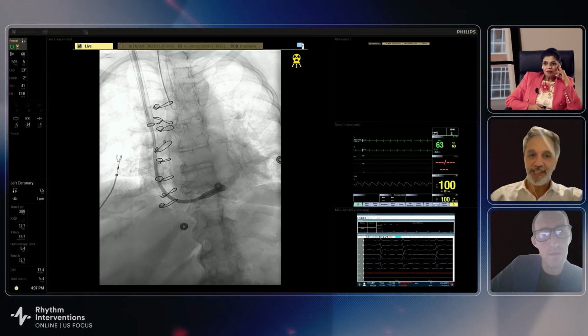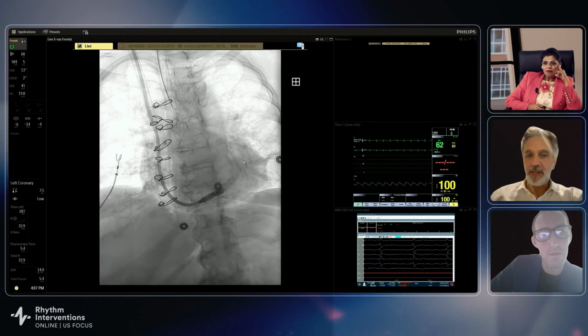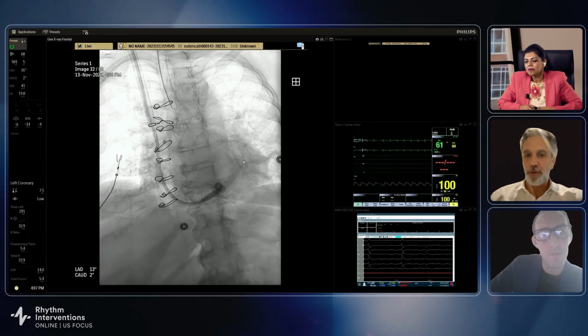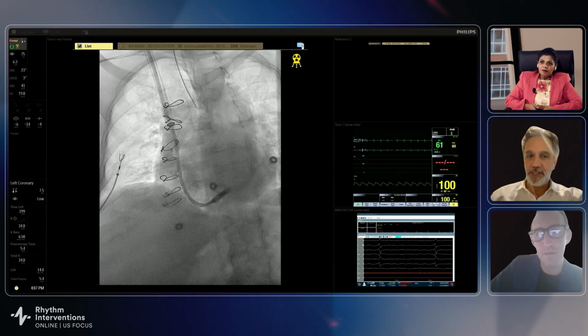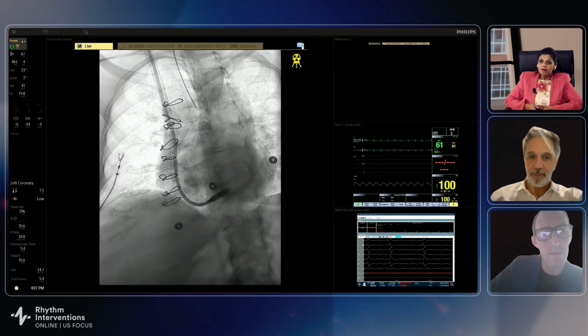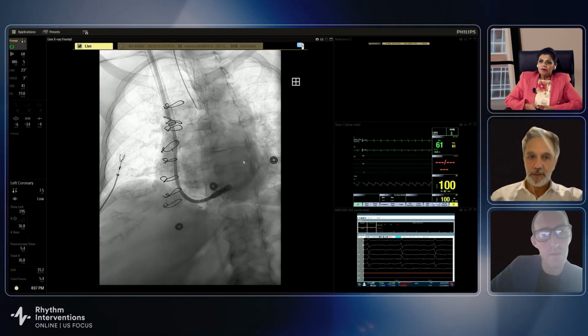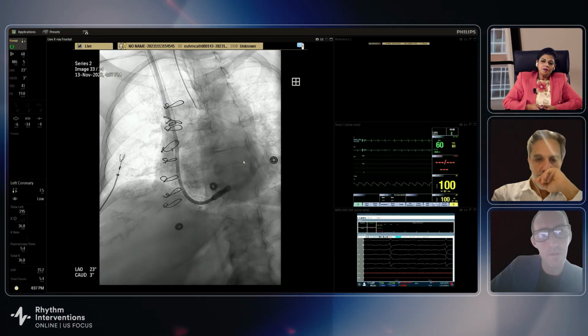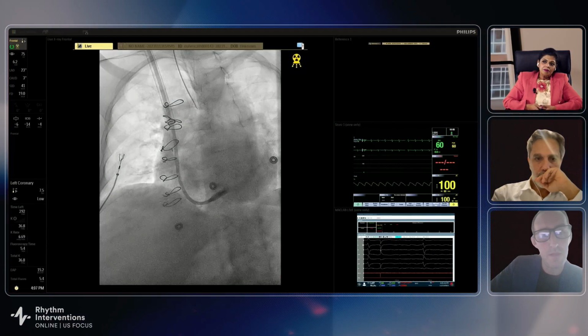You see us here injecting dye. And really, the hardest part of this procedure is getting the sheath down. But there was one deployment, if you look at it here, and you see the flamingo, reverse flamingo appearance. Okay. Just have fluoro ready.